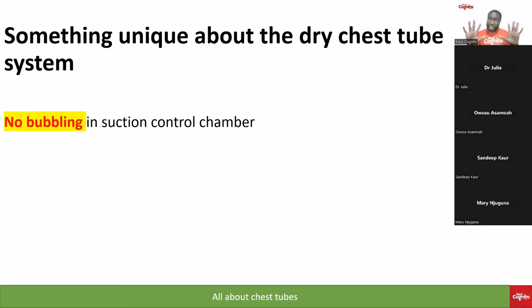Again, the typical chest tube, which we see in many of our hospitals, has three components. Can somebody remind me of them? I need one person, whether Dr. Amma, Dr. Cecilia, Amma, Hannah, Mary, Nanaya, Prince, anyone can just tell me what are the three components of the chest tube and what are their functions?